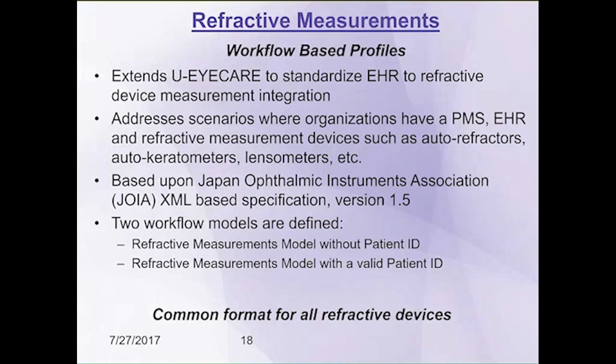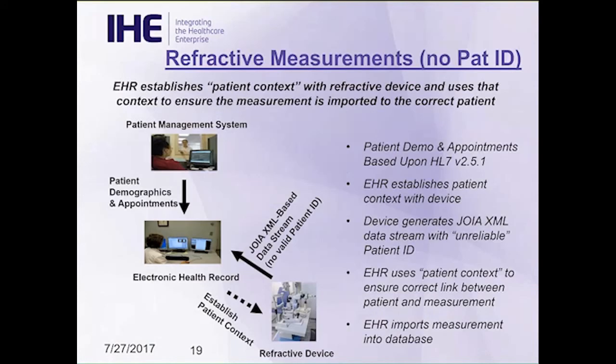So let's take a look at the workflow here. If I'm incorporating refractive devices in my system, of course, I still have a practice management system and an EHR that need to coordinate the patient and appointment data. None of that changes. That's exactly the same as you saw in Real World Model 1, 2, and 3, and also here for refractive measurements. But of course, the difference now is I'm connecting to a device that does not necessarily have as much computer power as you do when it's an OCT or a fundus photo. And so that's where this is a different workflow, and it changes.